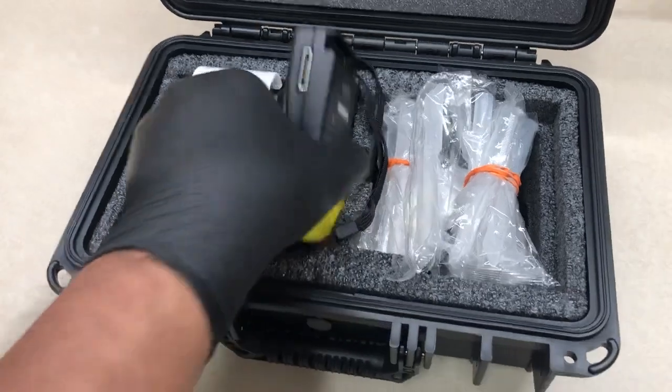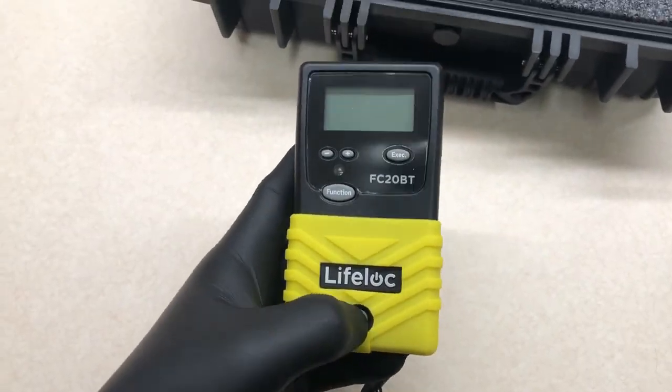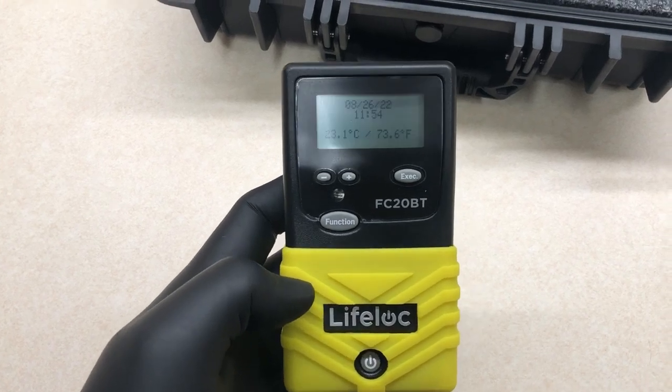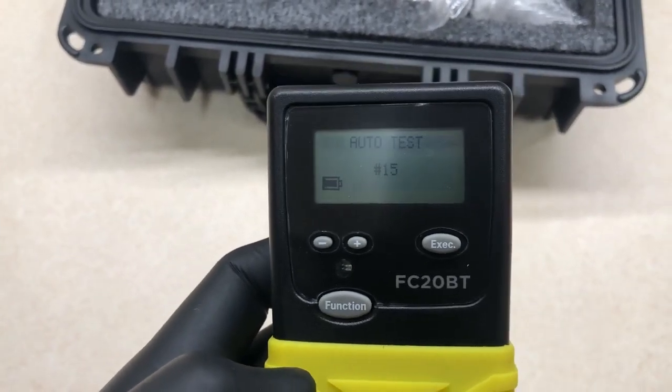So what you're going to do is go ahead and power on your printer, and then second, you're just going to be pressing the power button on your breathalyzer just once real quick. It doesn't need to be held or anything like that. Make sure the date and time is correct, and then it's going to automatically switch over to auto test.